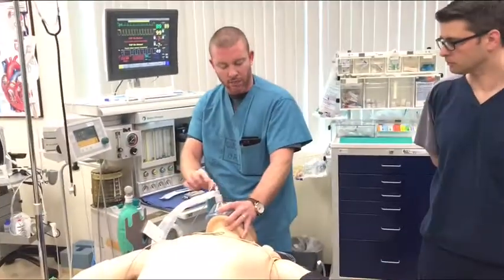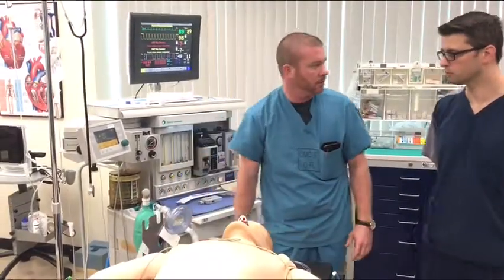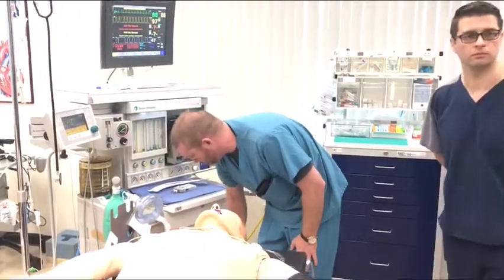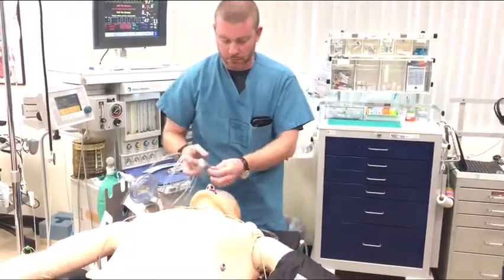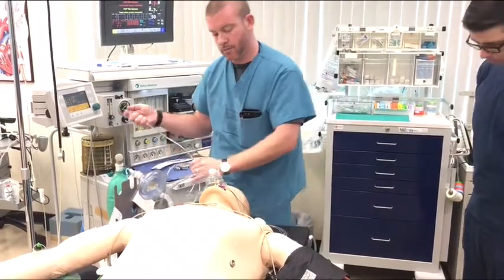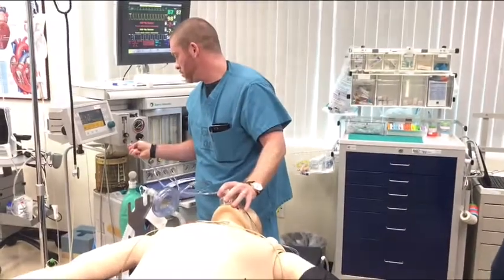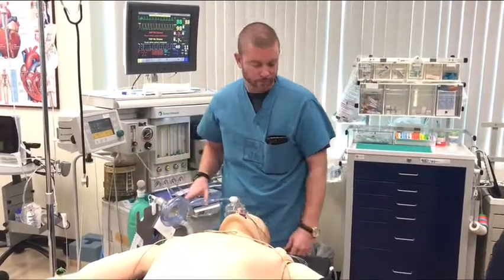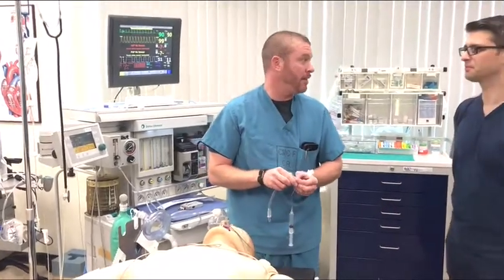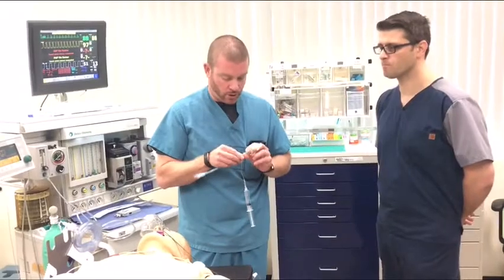I did notice there's fog and mist in the mask. What's my next thing? What's my next face thing? Face mask. Put your face mask on. Watch it. Simple, right? See how fast that was? I didn't go fast. That's exactly how fast it's going to be for each one of you guys. Okay. Questions?